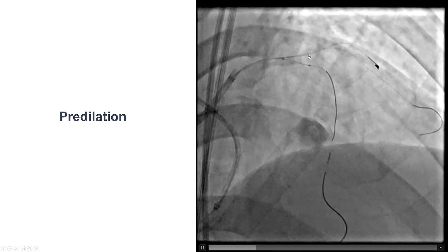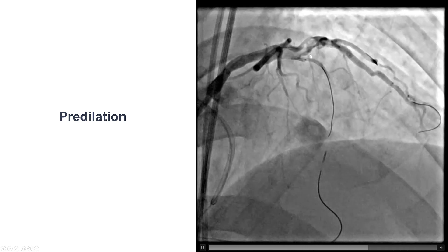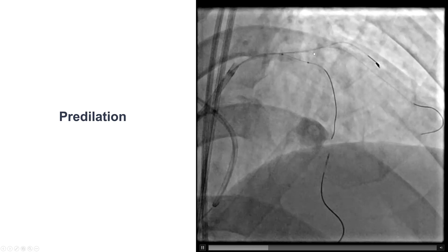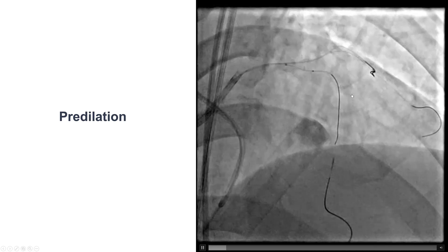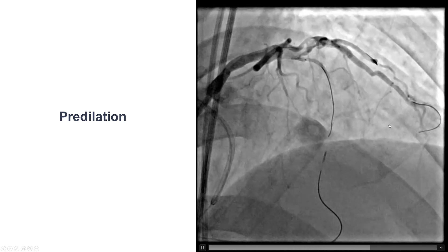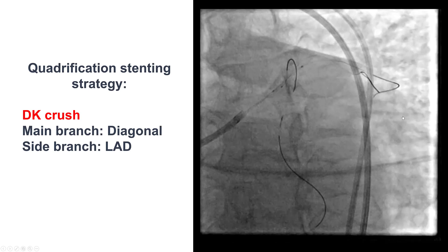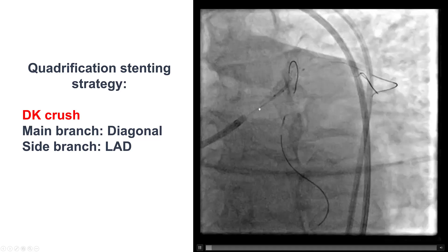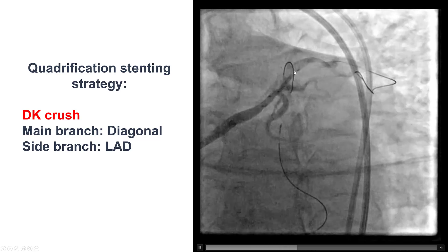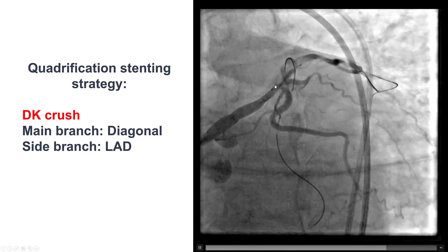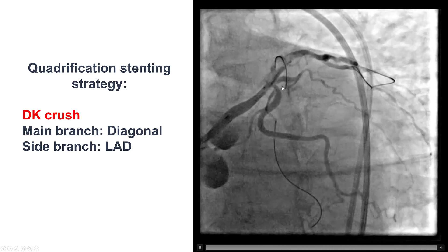We had some difficulty losing access to the diagonal but were able to regain it. After predilatation, there is an extensive area of dissection in the diagonal branch and some flow going into the LAD — not perfect but there is some antegrade flow. The anatomy constitutes technically a quadrification: the distal left main, the circumflex, the ramus, the first diagonal, and the actual LAD. However, the circumflex and ramus don't appear to have significant ostial disease.